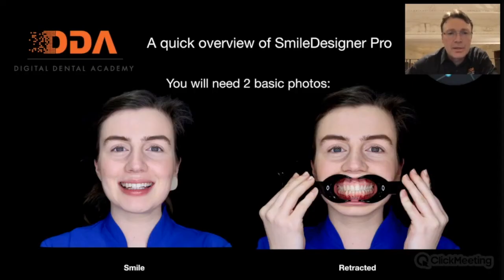So what photos do you need? You just need these 2 basic photos. You need a smile photo, and ideally you want the head set back so that you can see the ears, and you want a little bit of space between the incisors. So the teeth are not in occlusion, and you want a little bit of blackness showing behind the teeth. Looking at the retracted photo, I made a mistake: the patient was in occlusion. It doesn't matter so much for the retracted photo, but it makes it easier to do the alignment of the 2 photos where they are overlaying, and you'll see that in the demo in a moment.